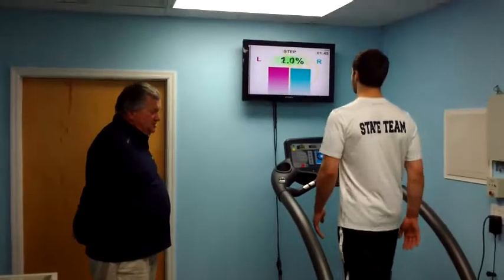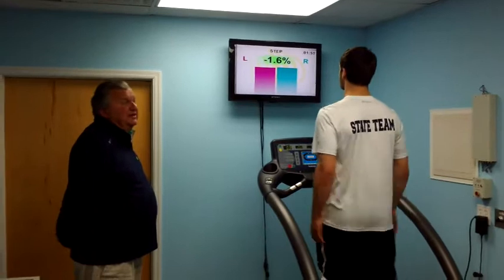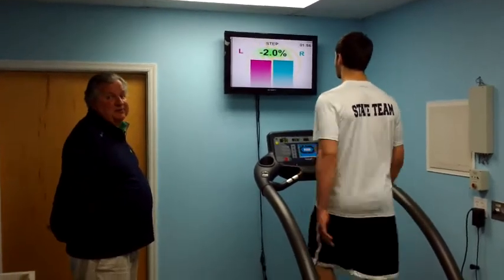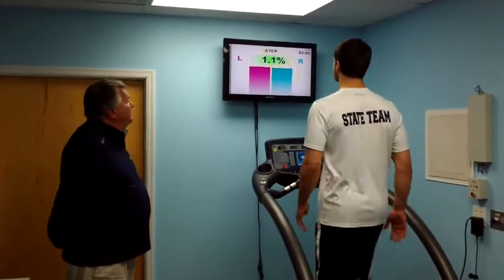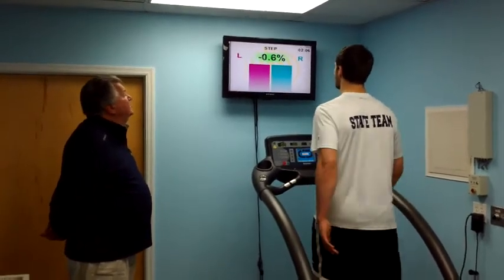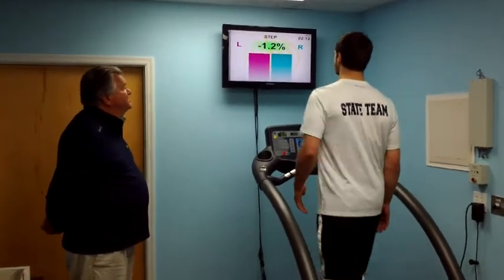Regular re-education. He's reducing the asymmetries in his gait cycle with each step that he takes, while he's getting biofeedback telling him the parameters of his gait cycle and the amount of asymmetry. Right now we're doing step length. He was off by 4.8%, and with some encouragement, he reached out with his right leg, and now he's hovering down in a fairly good zone of around 0 to 2%.